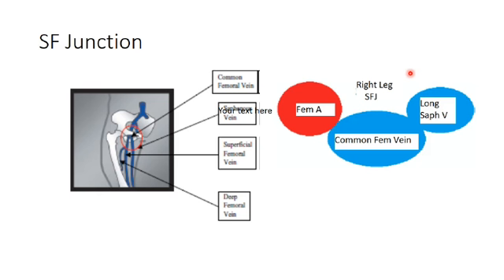One very common problem is that the pressure of the probe is easily enough to occlude the long saphenous vein, and you often keep searching for it, and if you just release the pressure a little bit, you can get it back. The second is that sometimes if you're at an oblique angle, you may only get one of the two ears, and if that happens, you might have to rotate the probe and correct the angle a little bit.